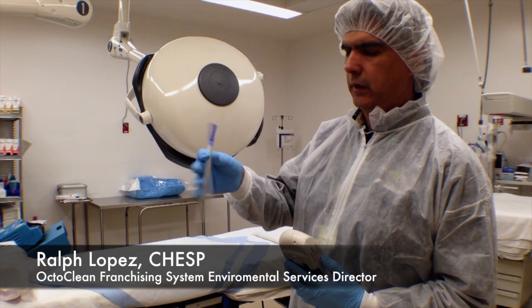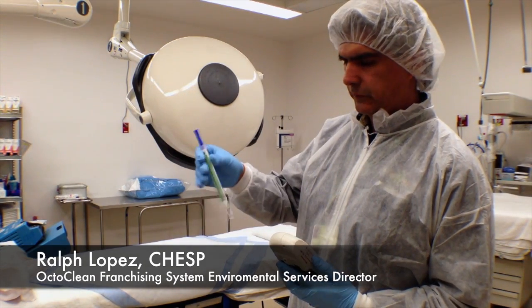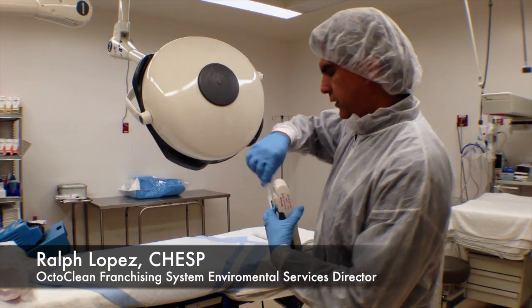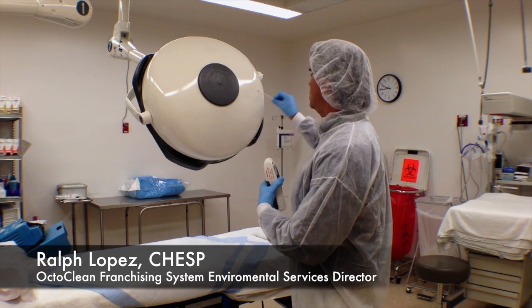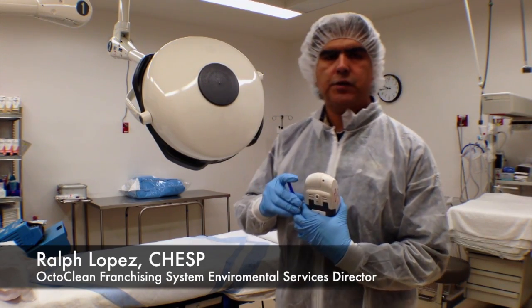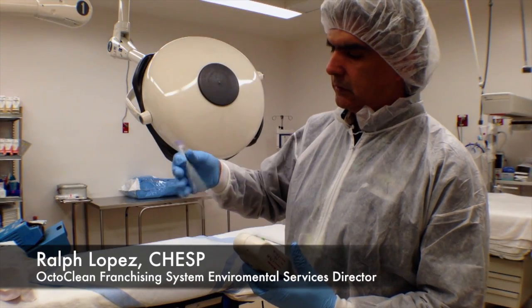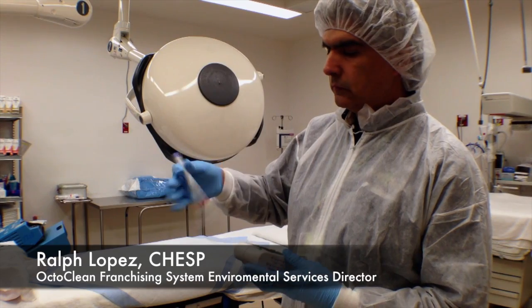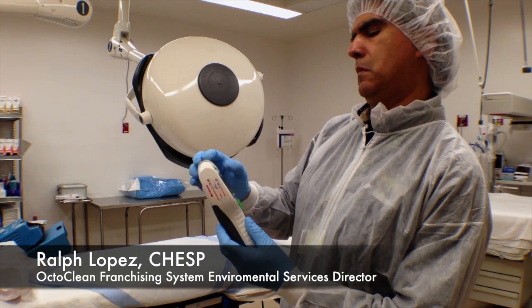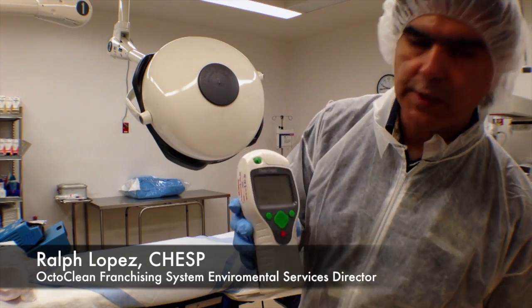I'm going to swab it first with the ATP swab. I'm going to shake it up a little bit to get it started, then go ahead and swab the test area. I'll insert the swab back into the receptacle, shake it up for a few more seconds, and then insert it into the CleanTrace unit. I'm going to go ahead and measure the sample, and as you can see it's now measuring.